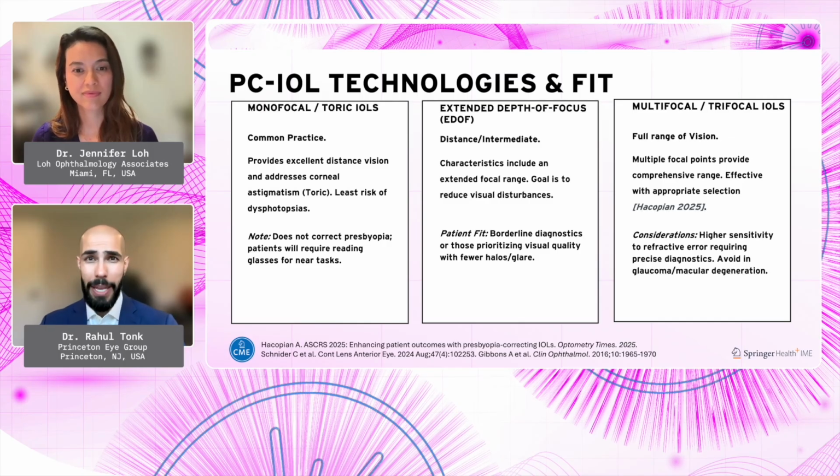And then, of course, the patient's involved in that conversation as well. If this is a patient that really doesn't have that much friction with eyeglasses in the first place, then is it as necessary for them to trade off some contrast? And just keeping in mind, by the way, that these patients already have tremendous contrast loss from their cataract that they're coming in with. So most of these designs are going to be better than their preoperative contrast sensitivity with cataract. That was an example for glaucoma, but that all has to do with contrast sensitivity.